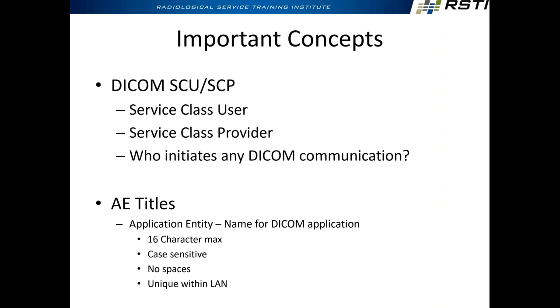So these have to be unique within a LAN, so unique to the hospital, no spaces, they're case sensitive, and 16 characters is the max.